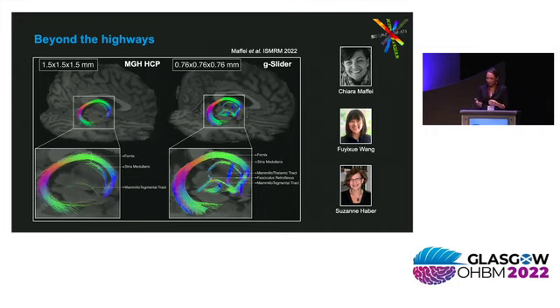But going forward, we would like to take advantage of a combination of super resolution methods as well as the anatomic priors that I showed you earlier, so that one day we can use the high-end training data that we get from manually annotating these bundles in the sub-millimeter resolution data to be able to reconstruct these tracts more reliably in scans that we can acquire in less amount of time.